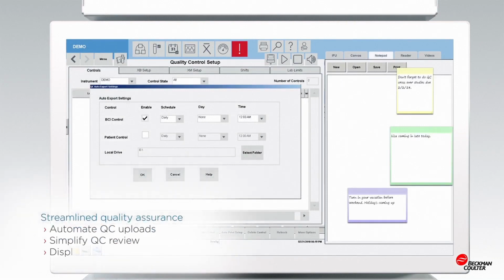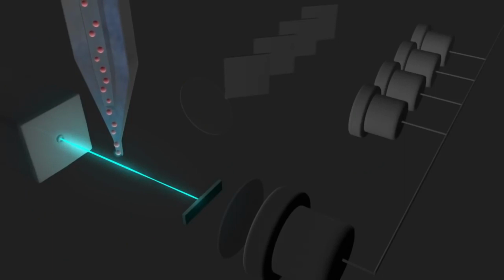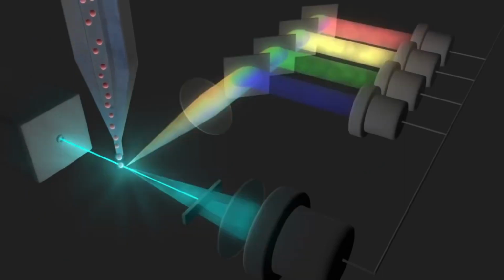5-part analyzers are more expensive than 3-part analyzers, but provide much more in-depth information about the sample. Specific jobs, such as allergy testing, require 5-part differential analysis. However, most medical tasks can be completed with the 3-part analyzer.